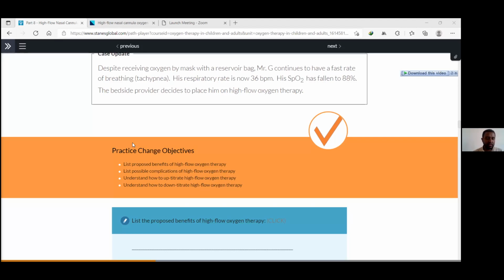And other answers: economical, can be used at the emergency department, pre and post extubation, that's excellent. Hayat said better tolerance, apneic oxygenation, that's excellent too. And less dead space ventilation. Haptamu said faster patient recovery, and can be used for obstructive sleep apnea. I think these are some good comments we are getting now.